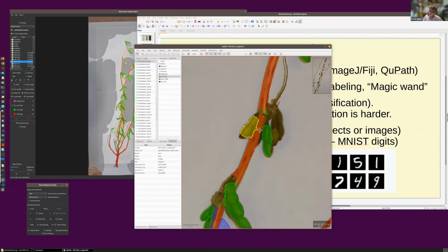And there are ways, QuPath has a nice tool for, let's say this shouldn't be, so see, I can take that away. But that magic wand tool, that ability to click on this and just have it fill something in like that.